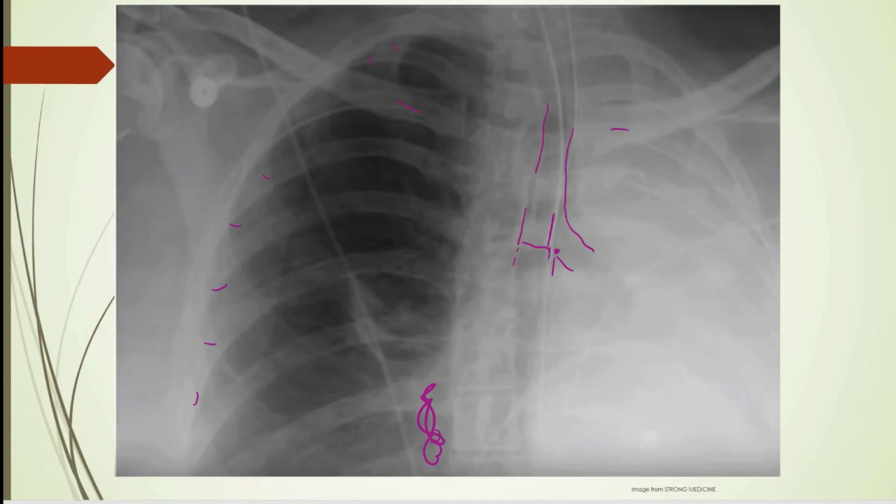Remember, with ultrasound, you can rule out a pneumothorax. You cannot rule in a pneumothorax unless you find a lung point. Of course, that's for a different lecture. But you can at least see that there's no ventilation or the lung's not moving on the left side with ultrasound, and then you could wonder why. But really, your stethoscope here should pick it up. The nurses should pick this up.